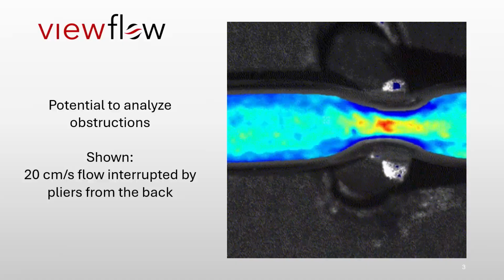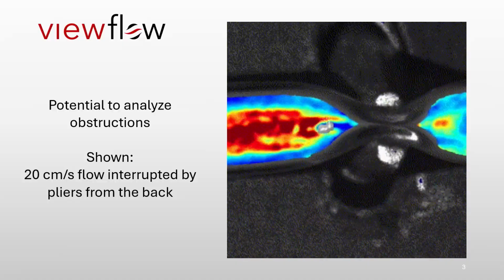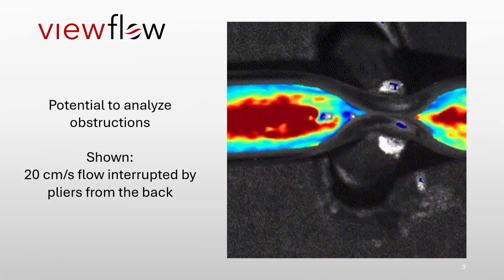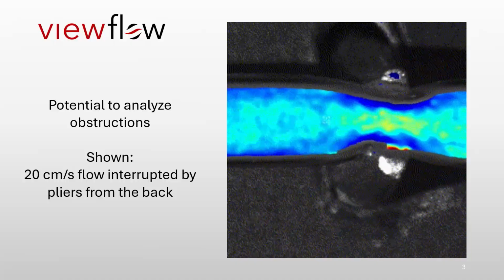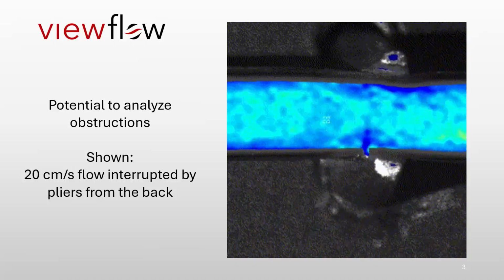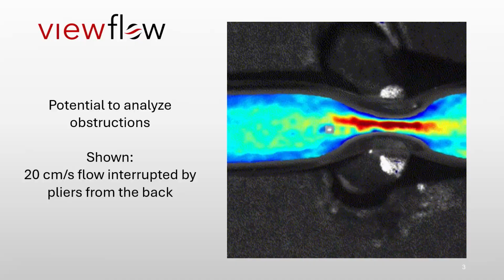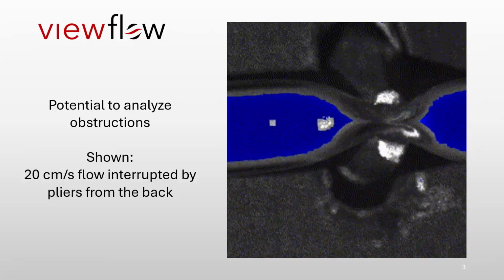Another view is blood being pumped through a tube at 20 centimeters per second, and then pliers from behind cutting off the flow, to give you a sense of the dynamics that are visible at these speeds. And there are probably many clinical applications that can come out of this, and we're looking for that kind of guidance and co-development partnership on the clinical side.